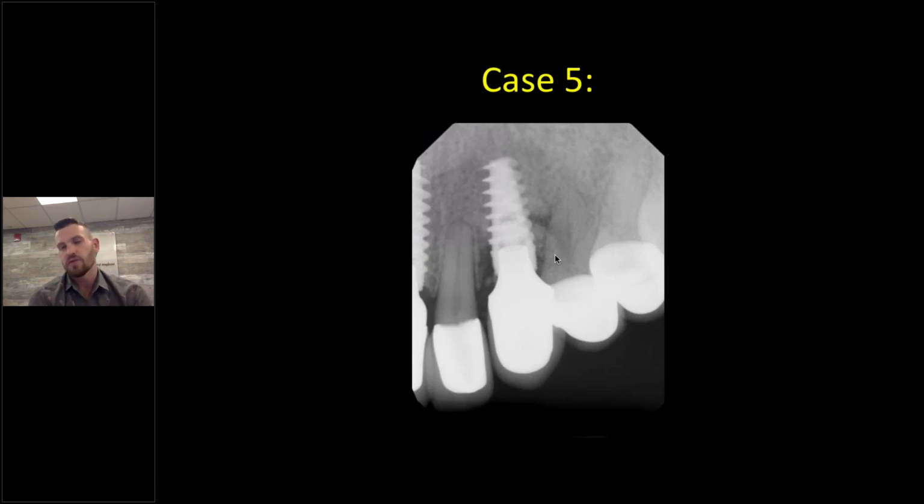It didn't work. The tissue was removed, and a bone graft was tried, and that didn't work. So we know it's a failing implant, and really the only treatment is to have it removed. You can see the bone loss is quite significant, and she's starting to develop mobility on tooth number 10 and tooth number 12. That is a really scary scenario, especially since she's already invested so much time and money into it.